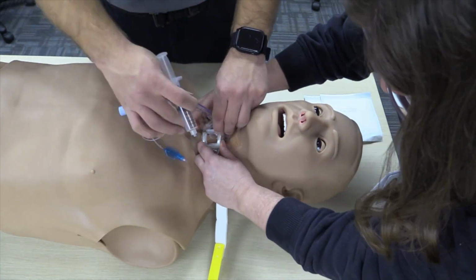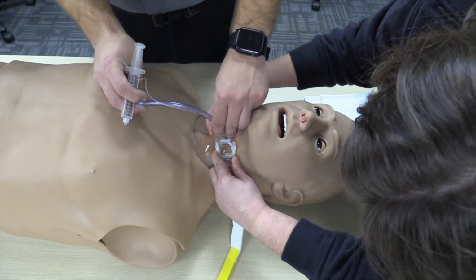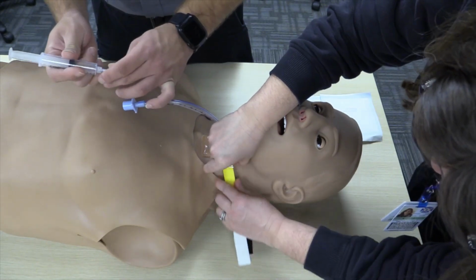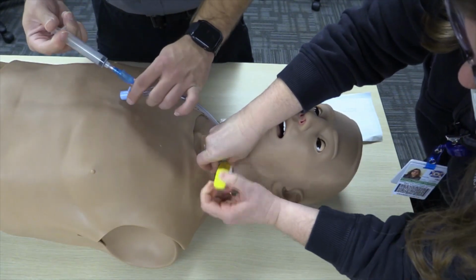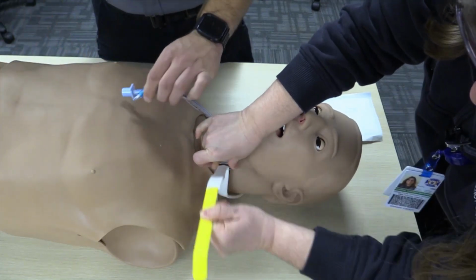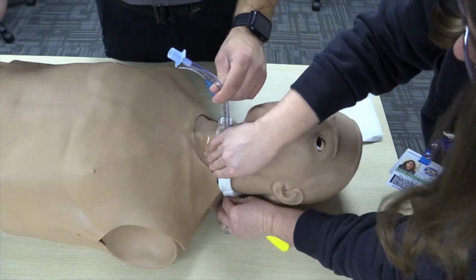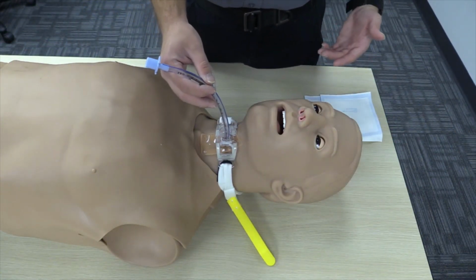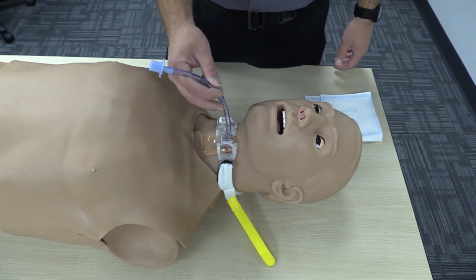We're going to take our securement device and secure this. We're also going to use our standard confirmation techniques. We're going to mark the number of where we're at on the skin, inflate our balloon, apply end-tidal capnography, colorimetric, auscultate lung sounds, and listen for absent epigastric sounds to confirm the placement. Okay. Document accordingly and notify your receiving hospital of what's been done.